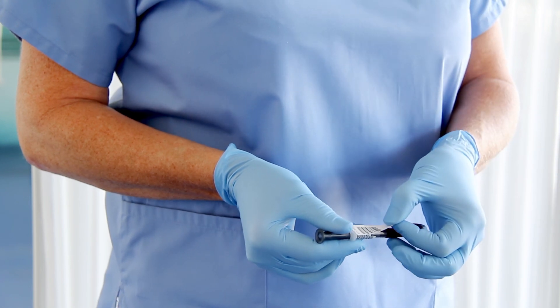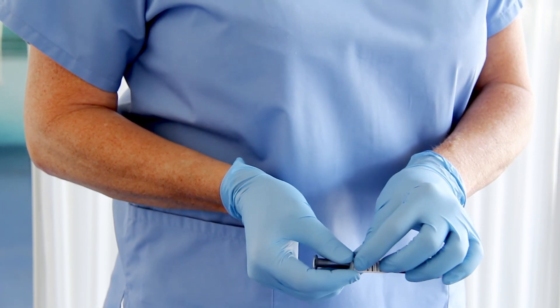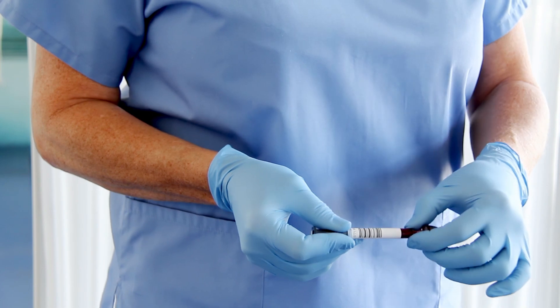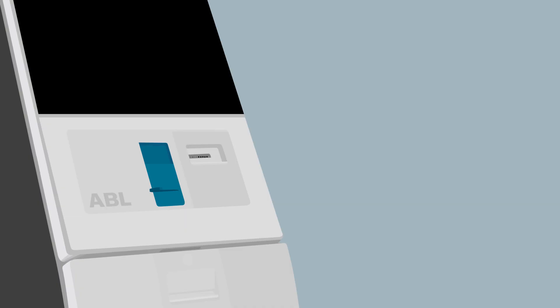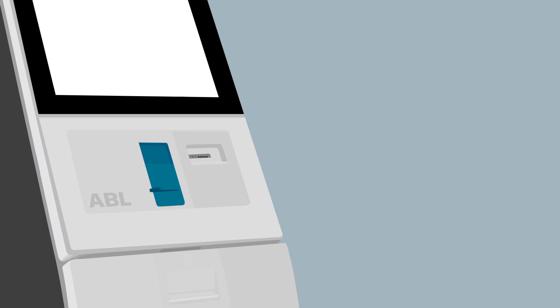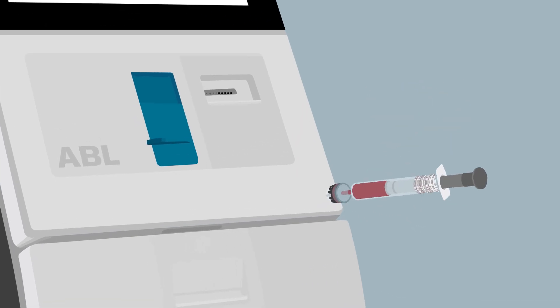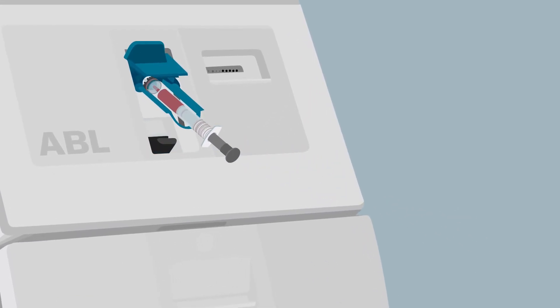Label the syringe with the patient ID and immediately transport the sample to the ABL blood gas analyzer. Enter the patient and sample ID into the ABL analyzer to ensure that the results are linked to the right patient. Mix the sample again to ensure that it is homogenous and place the syringe in the inlet to aspirate the sample.